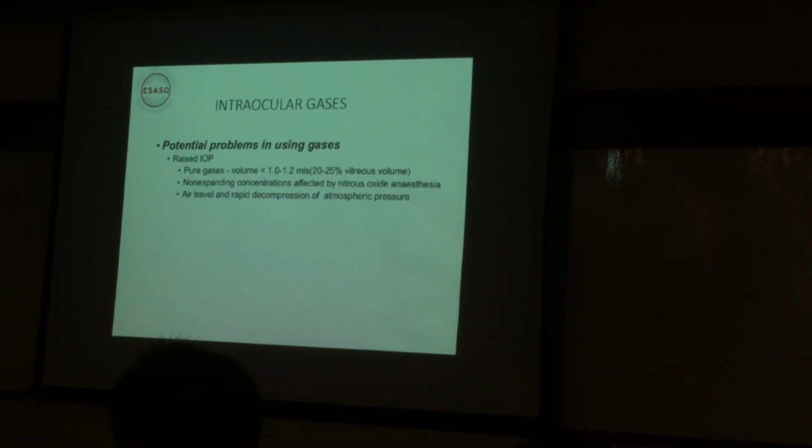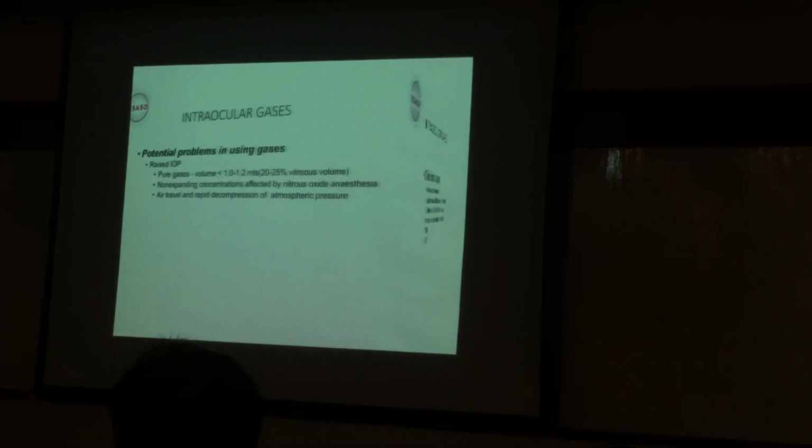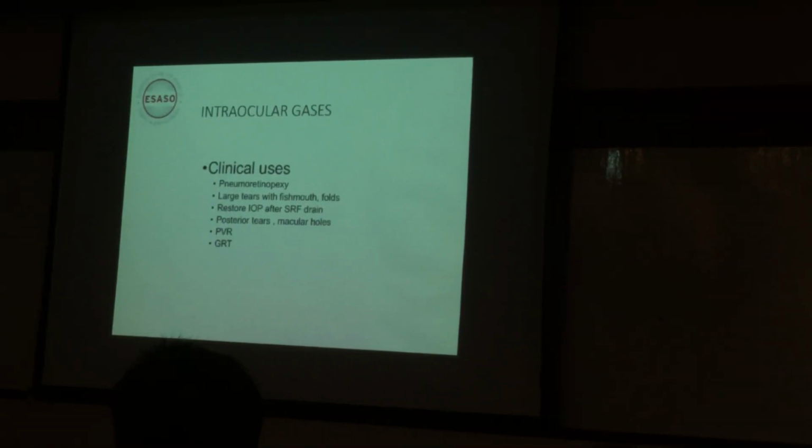Because the potential problem in using gases is raised intraocular pressure, through various reasons when you're using pure gases. So to avoid that, when you're using pure gases, the volume must not be large so that you don't occupy too much of the vitreous volume. And also take note, as I mentioned, during air travel, inform the patients that they are unable to fly.